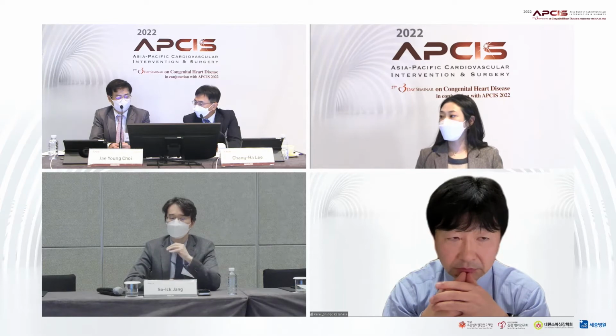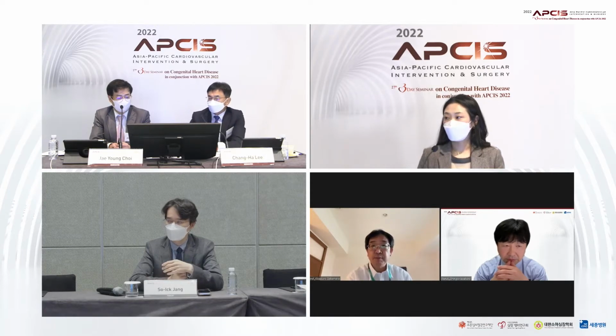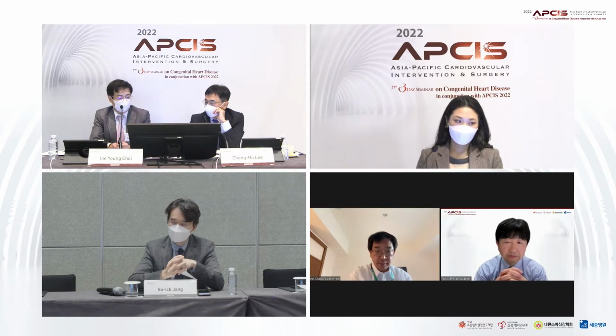Yeah. Historically, we struggled with that problem in the early 90s, and most institutions solved the problem with their own solution during the 1990s. However, in this patient, pre-operative CT shows LPA is hypoplastic. I don't think it is mainly kinking, but maybe LPA coarctation may be an underlying mechanism of the hypoplastic LPA junction.